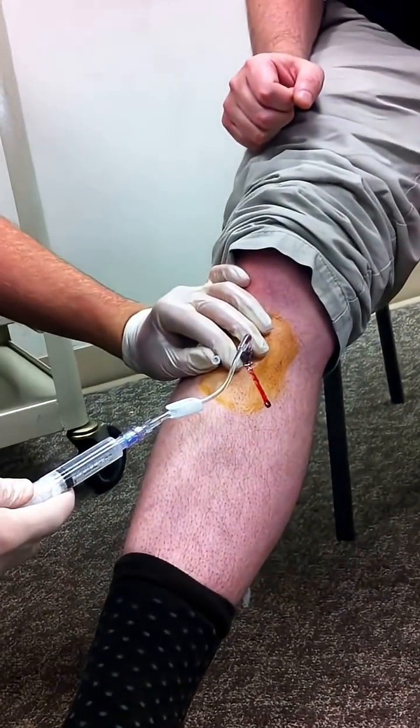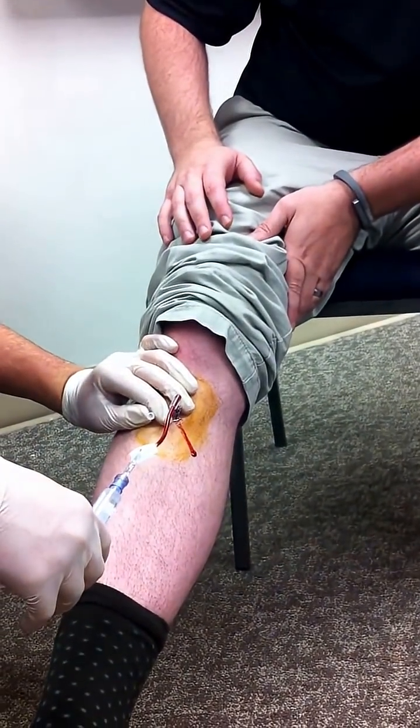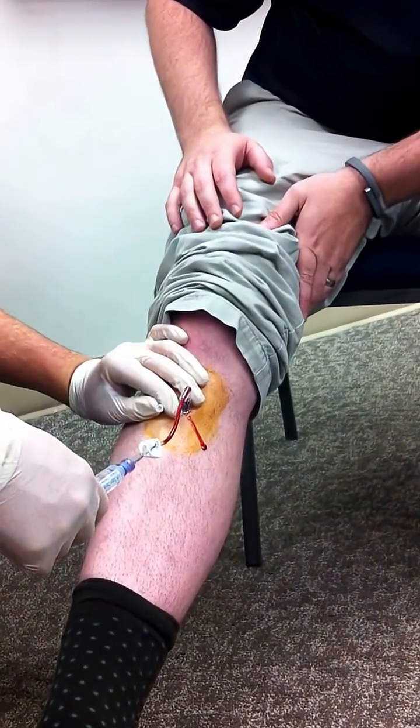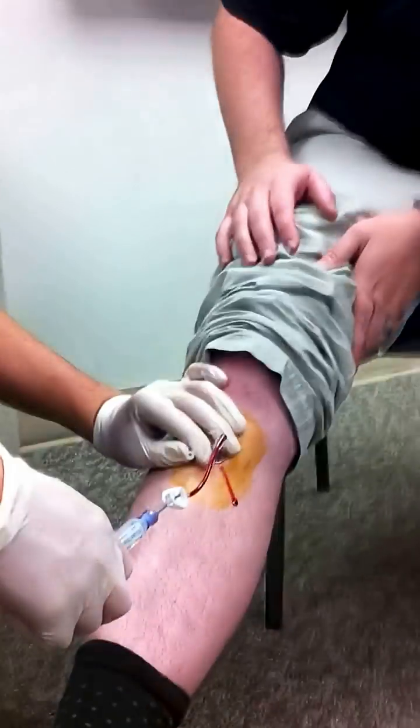I'm going to pull back just a little bit. What are you pushing in there? Lidocaine and a flush — we're supposed to aspirate a little. There you go, you're good. Is that a sharp pain? It's an achy — it's not like a real sharp. It's like the flu bone achy. The ache that you get after a break, not like the actual sharp. It hurts though. I'm sitting at 9 right now, going to push to 7 — or push to 6, because I know I've got an amount of blood in there.